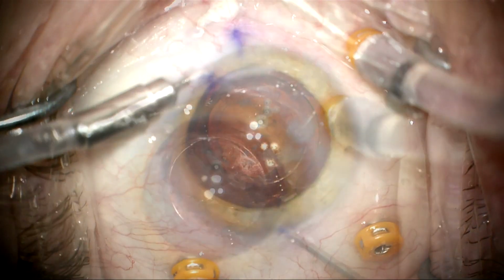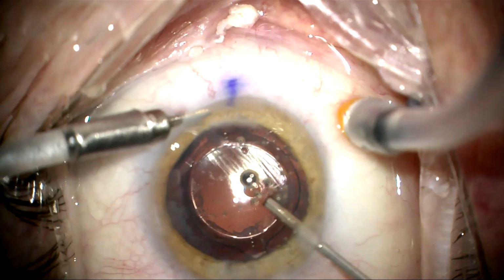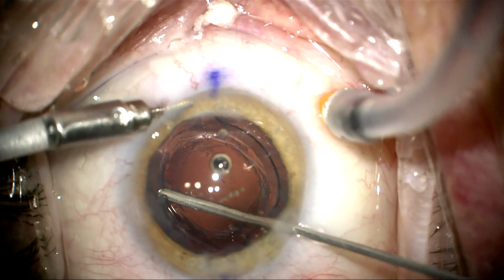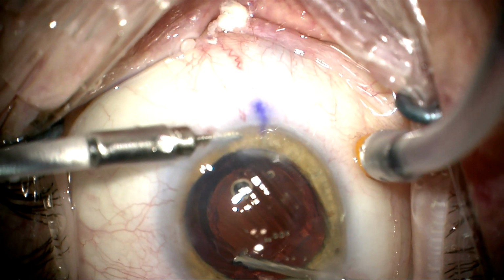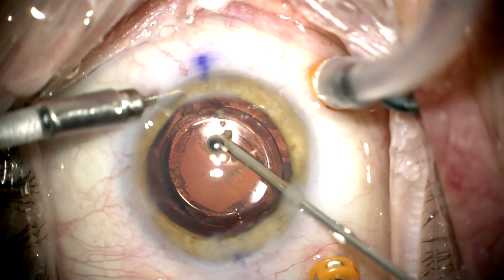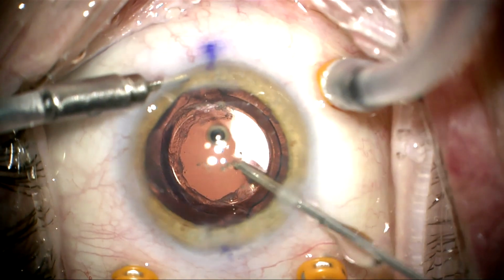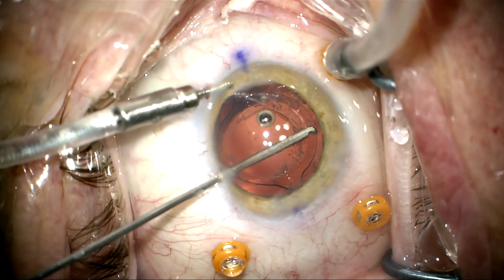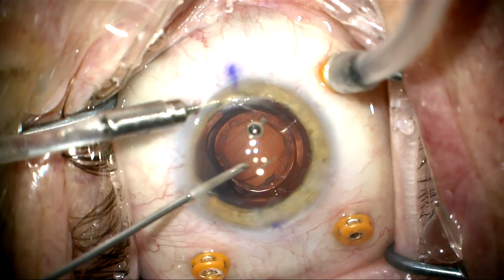We'll now move the infusion line into the anterior chamber so that we can do a cleanup in the anterior chamber. If I use posterior infusion, the chamber was shallow, so I'm switching to anterior infusion so I can shut the cutter off and use the vitrector on aspiration only to remove this cortical Soemmering's ring material from the capsular bag fornix. As I do this, I'm ascertaining that the lens is indeed under the anterior capsule and over the posterior capsule in the capsular bag equator. So I'm removing all of this Soemmering's ring lens material.